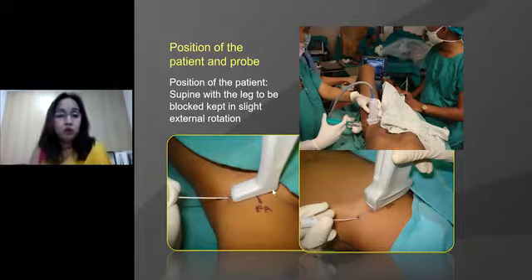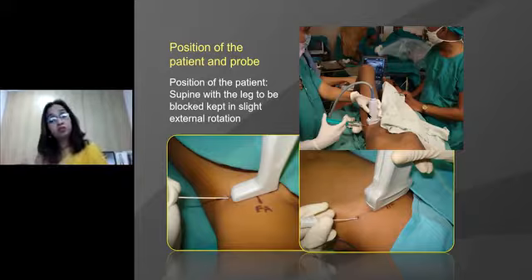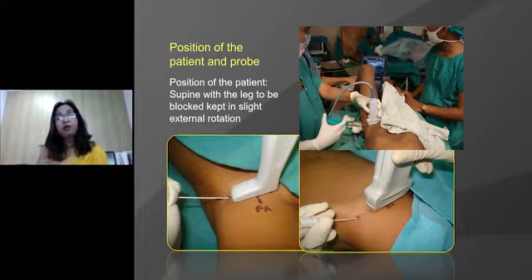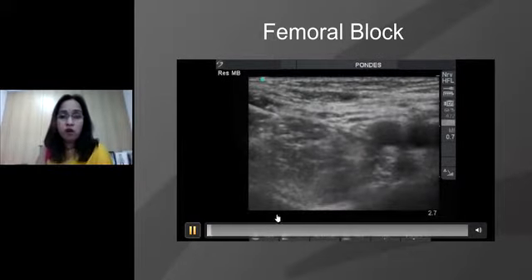Now, you can get congenital anomalies where the knees could be contracted, and we may not get a nerve stimulation response here at all. At this time, ultrasound does add a different dimension, and we can now put blocks where we otherwise would have hesitated putting for the sake of efficacy. And this is an in-plane technique, an out-of-plane technique also can be done, and this is a short video to show how it works here.